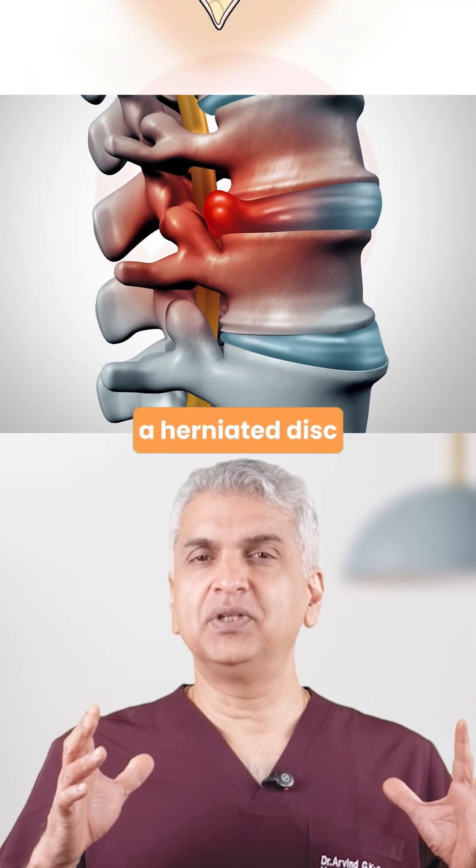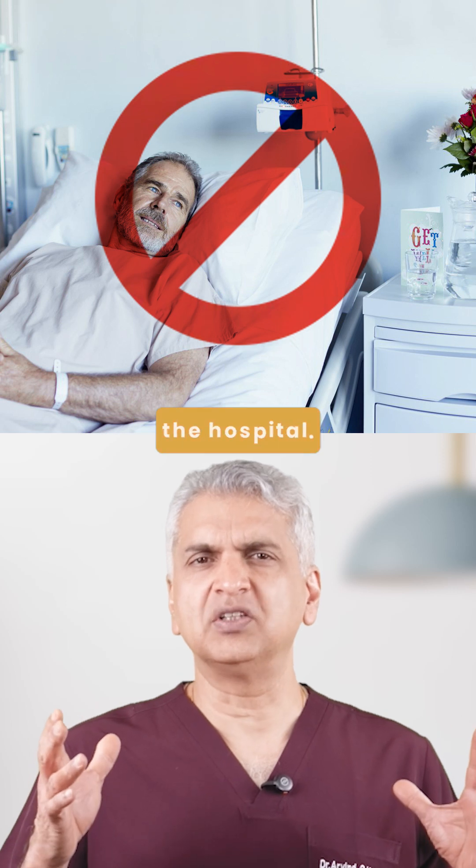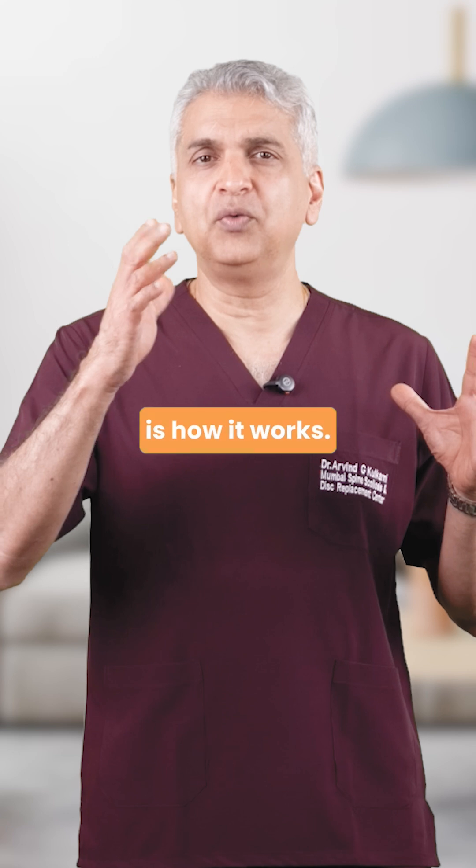Imagine fixing a herniated disc without cutting muscle, without a big scar, and with almost no stay in the hospital. That's how magical endoscopic spine surgery is. And this is how it works.